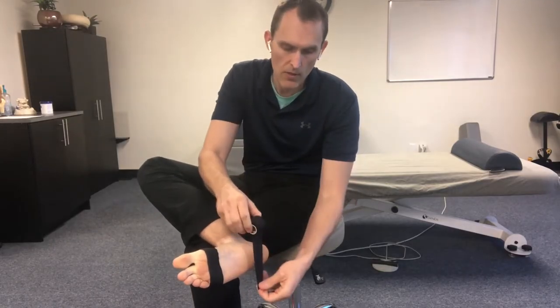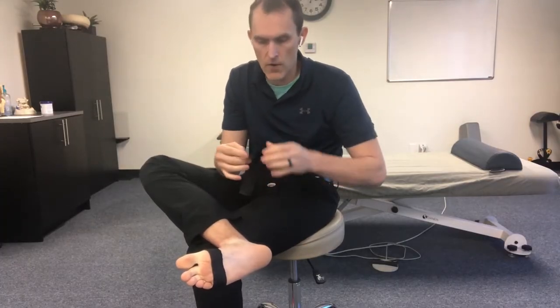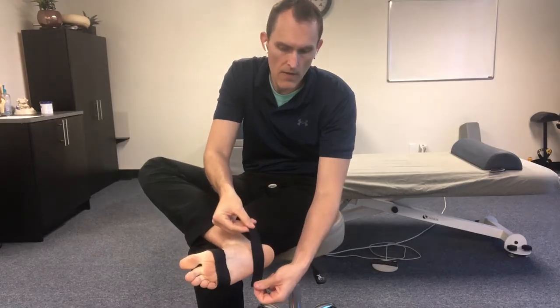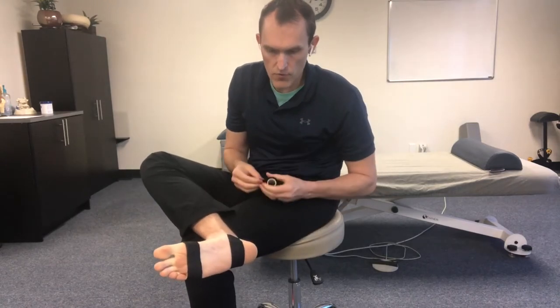Let's do the same on the bottom — just a little piece. This tape tears very easily, but you want to be careful not to wrinkle the wrap. Then I do the same thing there. Now I have those two pieces, and the tape is going to go from one anchor to the other. Once those anchors are in place, we'll start the taping procedure.